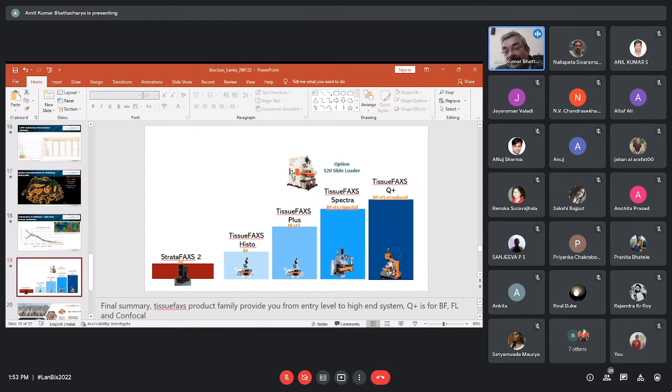Now, also, this is about informatics on a bigger scale. That means if you are doing a population cohort study, then you would need to actually run multiple slides, assuming that one slide is coming from one person or one patient. The standard microscope, which you see here in this picture, can accommodate only 8 slides. Good for a lab setup.